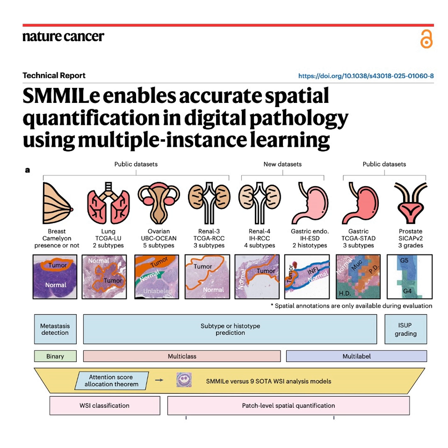Multi-label is where you get into mixed tumor heterogeneity. This is where a single slide, a single patient's tissue, contains multiple different types of tumor phenotypes all mashed together in a mosaic. It's chaotic. It's an incredibly complex map to draw.